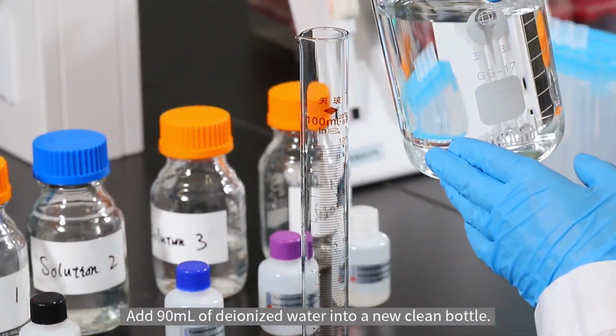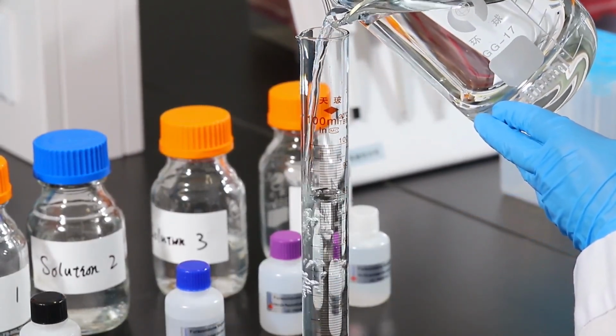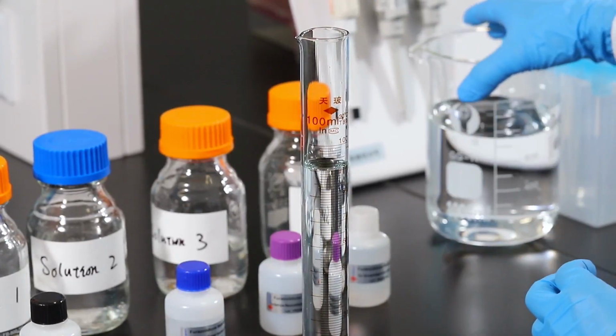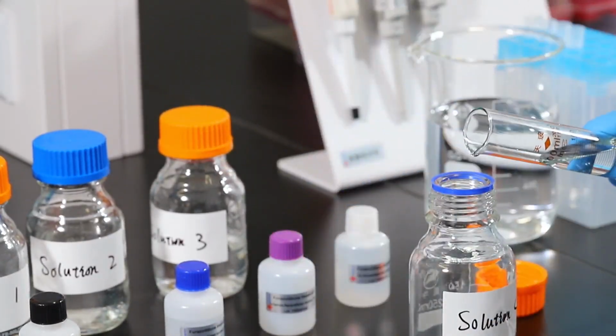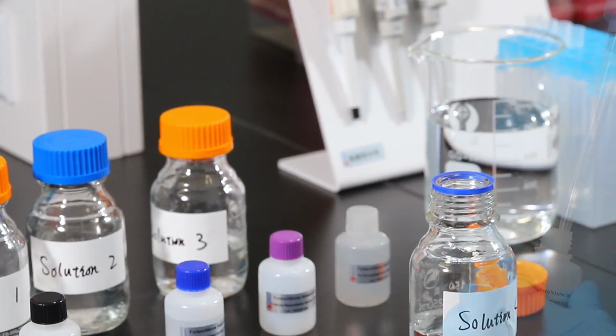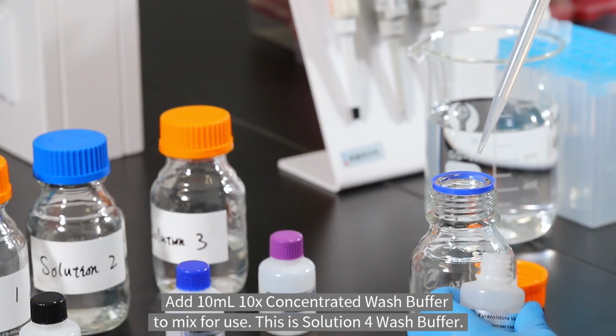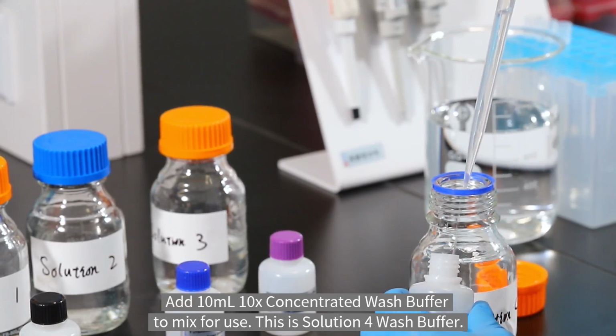Add 90 ml of deionized water into a new clean bottle. Add 10 ml 10 times concentrated wash buffer to mix for use. This is solution 4, wash buffer.